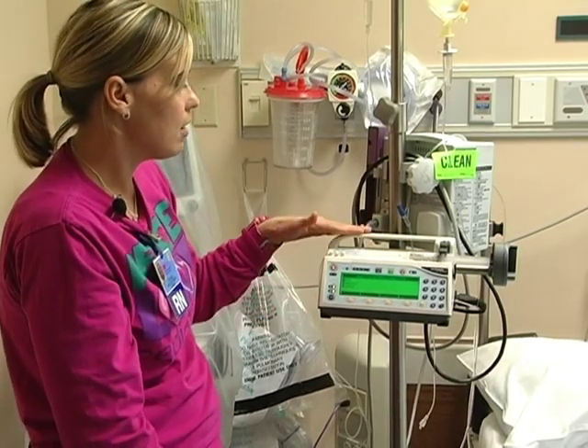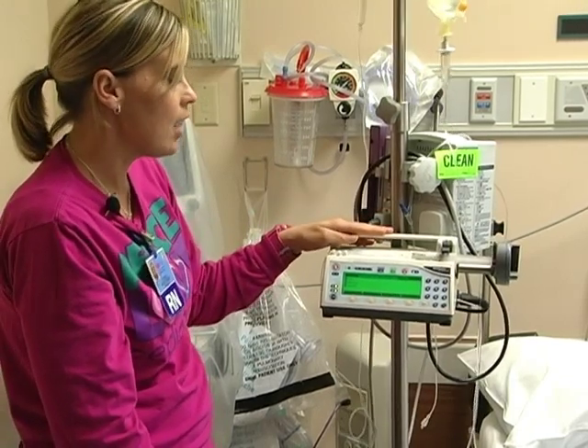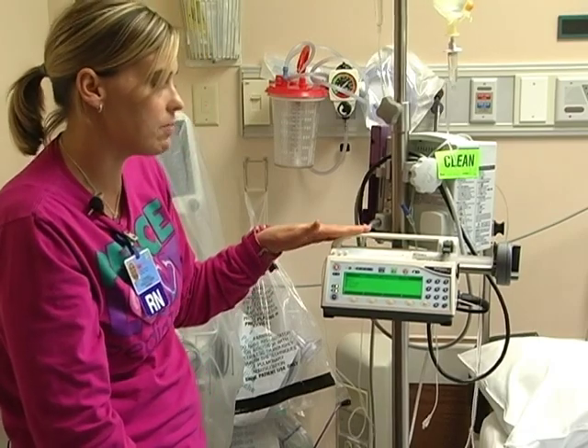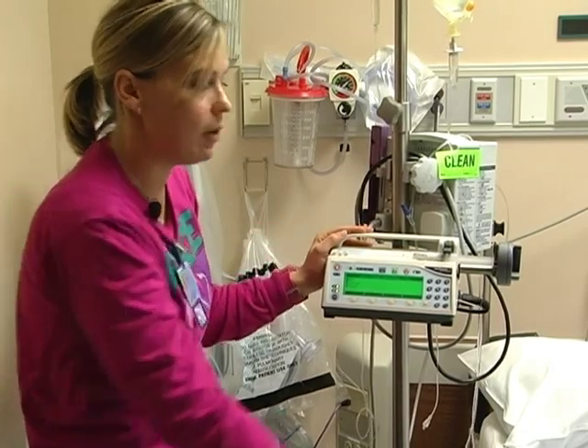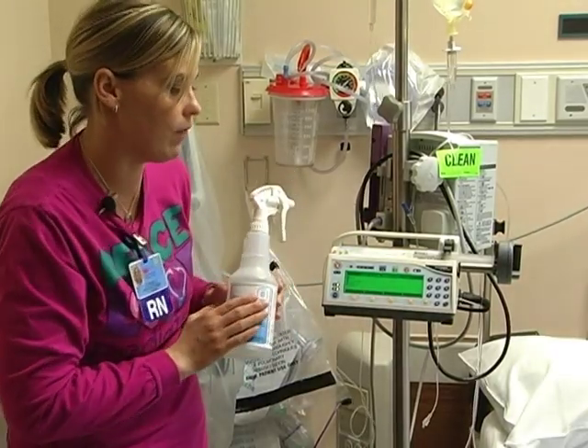On the inpatient side of Pediatrics, these pumps are cleaned by housekeeping. On the ED side, the pumps are cleaned by nursing and they are cleaned with Virex, not Sani-wipes, and that is per the manufacturer's recommendation.